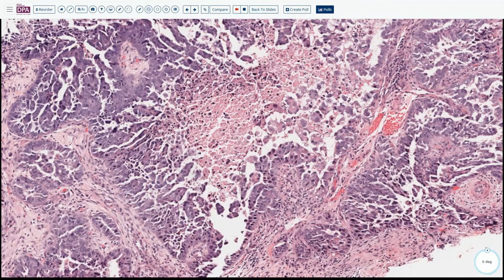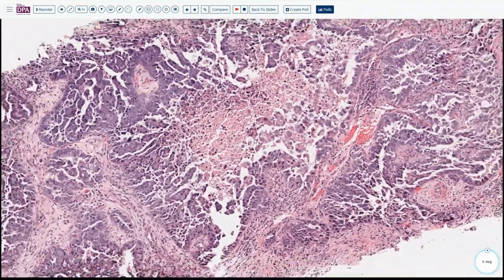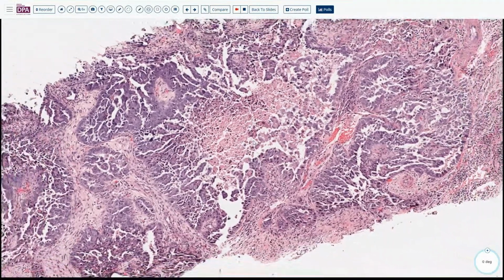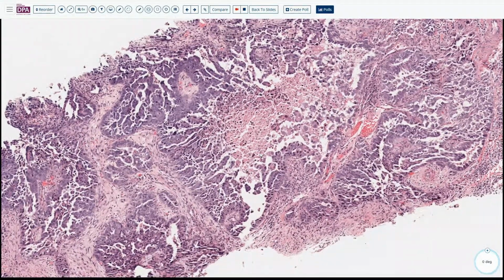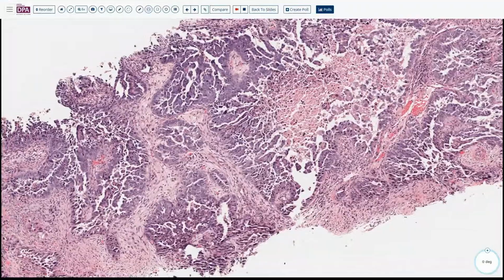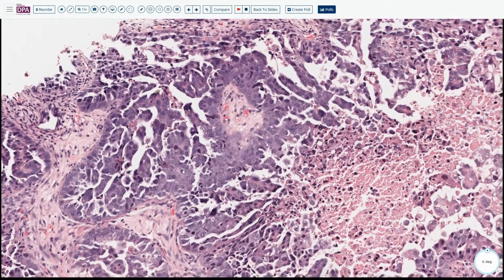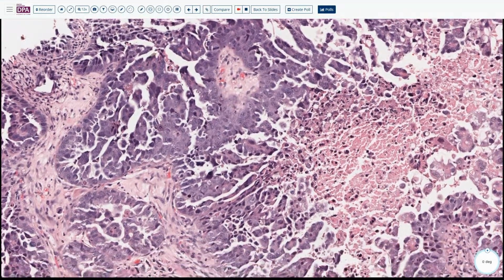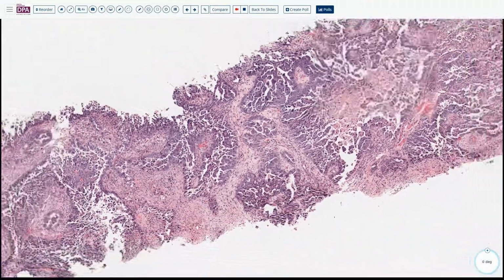Yes, in the breast we can see some high-grade carcinoma, but not that ugly. And then I give you ER/PR positive. If the breast carcinoma is that high-grade, it is really likely to be basal-like, that means triple negative: ER/PR negative and HER2 negative probably. But this one is ER/PR positive. And then we can see a lot of mitoses everywhere, and the cells are really pleomorphic, and there is no definite DCIS in this lesion.